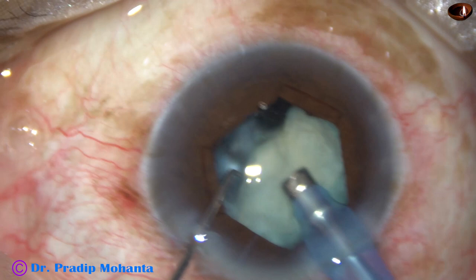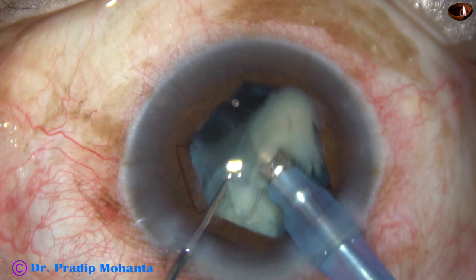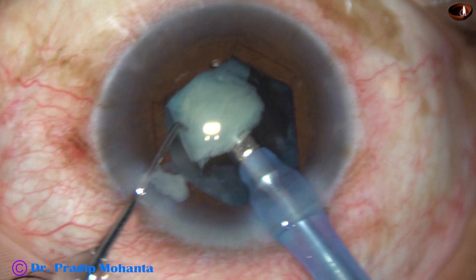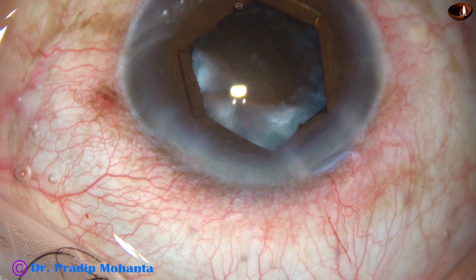Now this is the heminucleus. It is tilted and divided into pieces, then emulsified and removed. Phaco power used in this case is 45%, flow rate is 40 ml per minute, and vacuum is 400 mmHg.